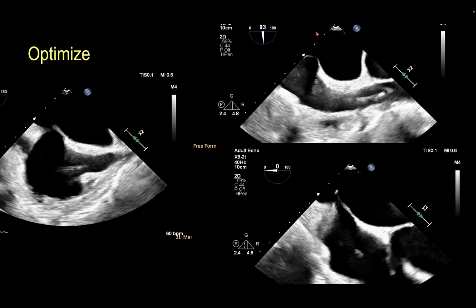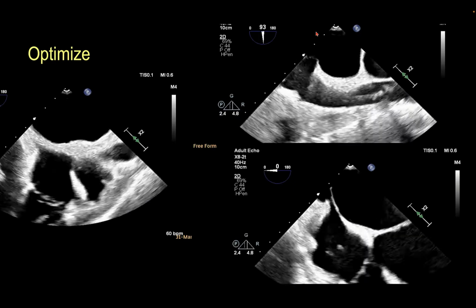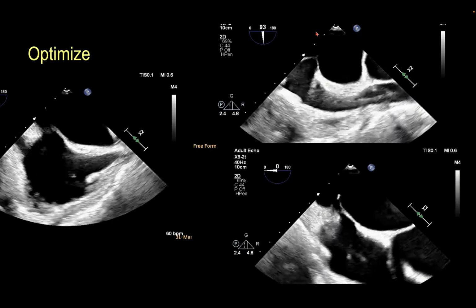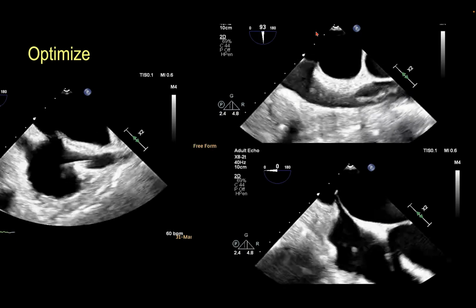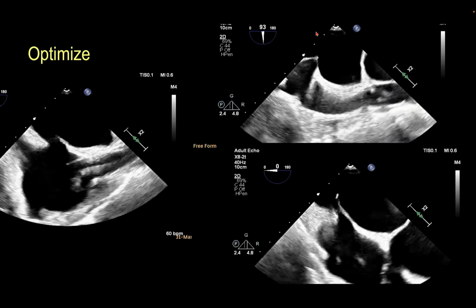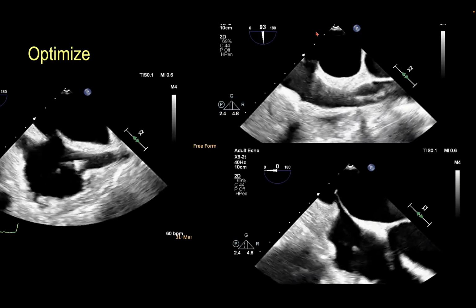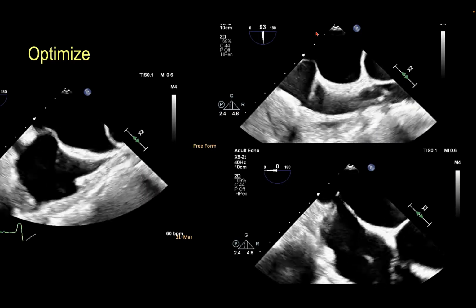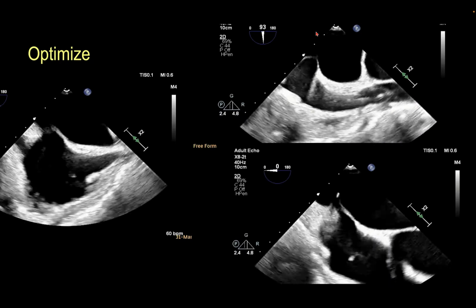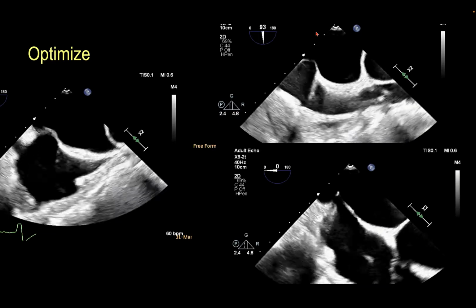And if you see in the lower right corner, you see that mid-esophageal four-chamber view, which we are using to identify what is erroneously misnamed as the height of the septal puncture above the mitral annulus, which again is a different discussion, but ideally people like it to be within about 4 centimeters. So in this case, you can see that it is a little over 4 centimeters. So that consists of optimization of the image. But you need to go back and forth sometimes at this location, because this is your last chance to be certain of where you are headed with this transseptal puncture.